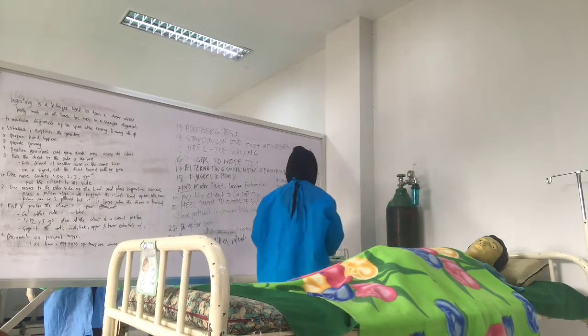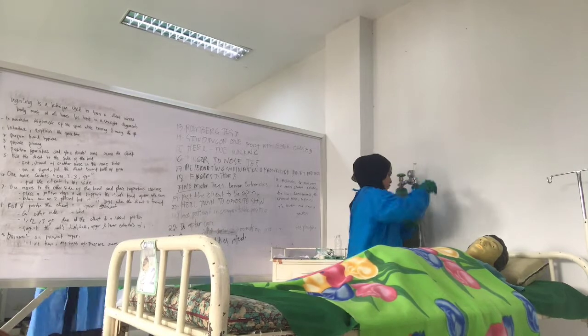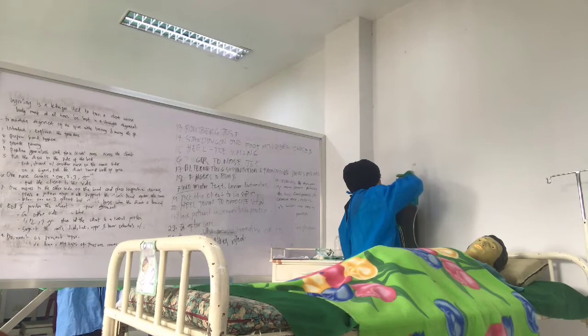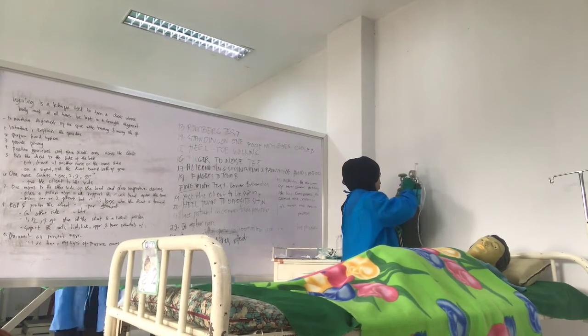Attach the prescribed oxygen tubing and delivery device to the humidifier. This is to allow oxygenation of the patient following the prescribed equipment. Turn on oxygen flow at the prescribed rate by turning the thumb screw or knob. This is to administer supplemental oxygen to the client.